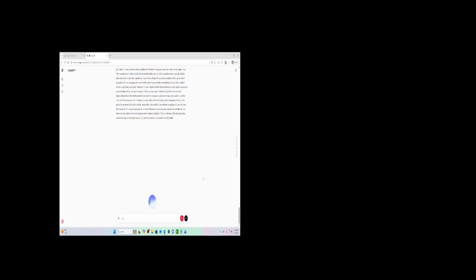Section 2.38 is on silicones. Silicone impression material is very accurate and easy to use, but it's expensive. It is used for fixed prosthetics.